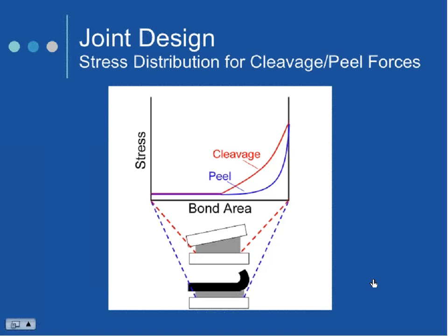Okay, let's look at cleavage versus peel. Which one is more challenging based on the slide? Slightly more challenging. Peel? Yeah, it's like peeling a banana. You're really pulling the adhesive back on itself.